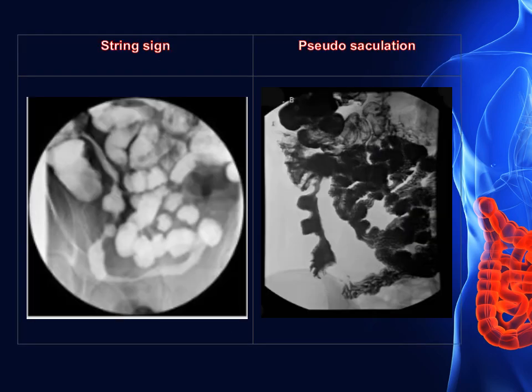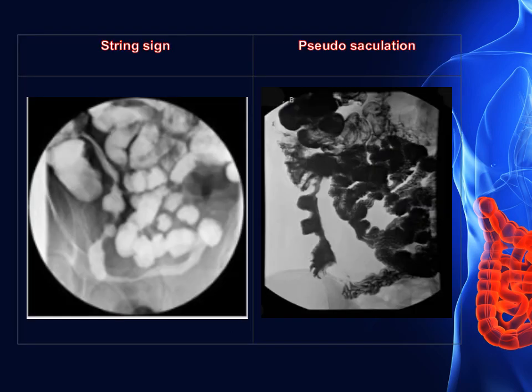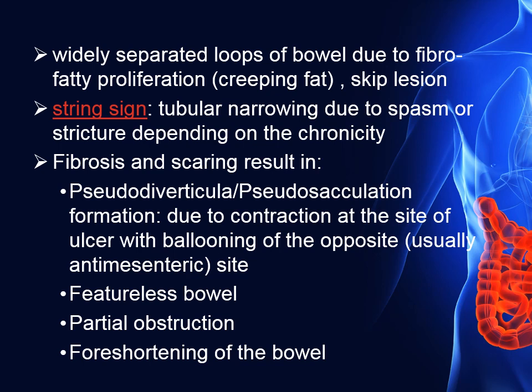The string sign is a tubular narrowing secondary to spasm or stricture according to the chronicity of the disease. This image also represents pseudo-sacculation, which is pseudo-diverticular formation secondary to contraction at the site of the ulcer with ballooning of the opposite side, and creeping of the fat between widely separated loops of bowel due to fibro-fatty proliferation. There is also a skip lesion — normal bowel followed by abnormal bowel.